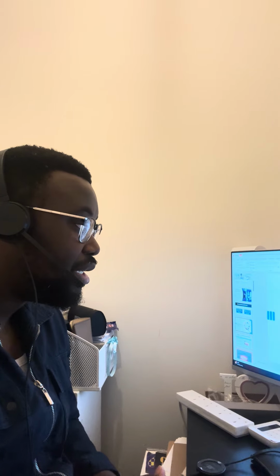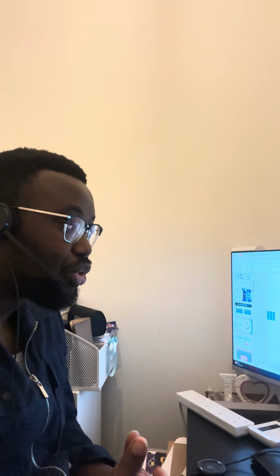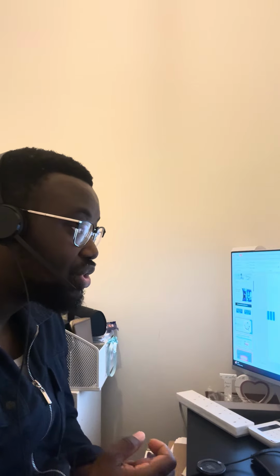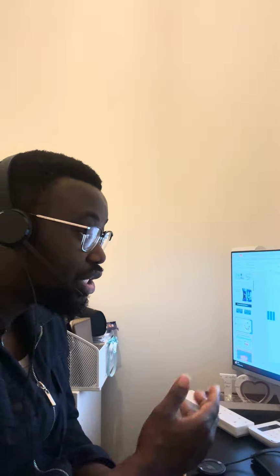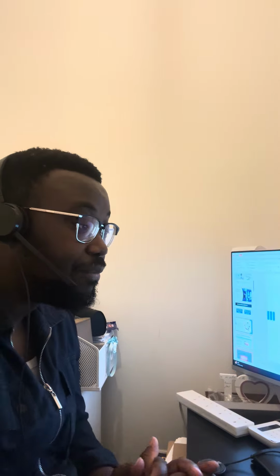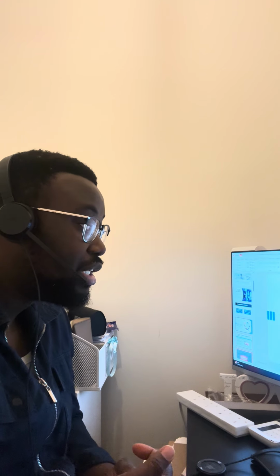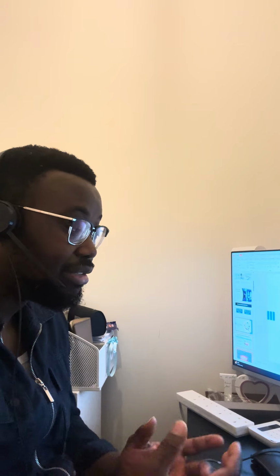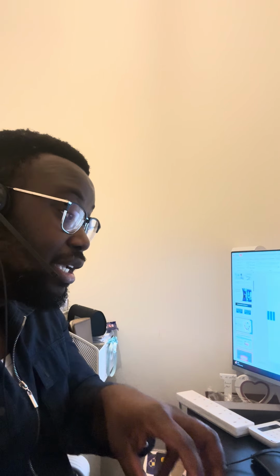If you look at this picture here, this again shows you the processes of digital denture production. Okay, you can see from the intraoral scanning to the CAD design, and then pushed to the printers where it is printed and manufactured. So you can see the curing equipment there that you use to cure the denture, as opposed to what you would do before. And then you can see the mounting, where you have to do the finishing touches, separating the denture itself from the holder when it is printed.